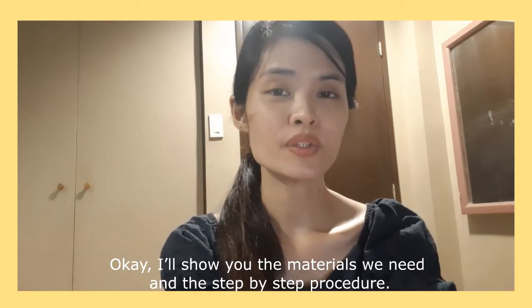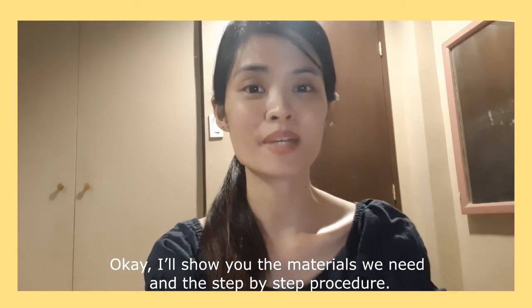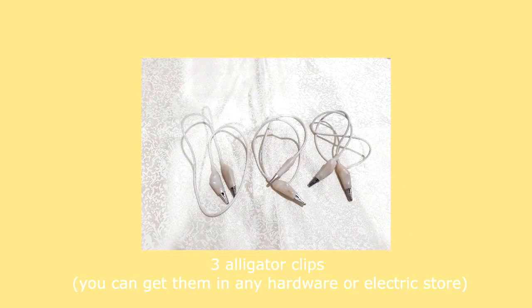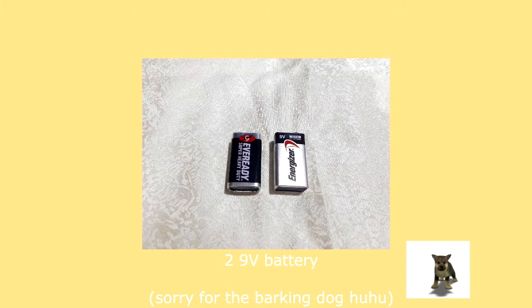I'll show you the materials and the step-by-step procedure. The materials we need are: 2 aluminum pans or stainless steel pans; 3 alligator clips — you can get them at any hardware or electrical store, and if they sell longer clips you may want to get them cut shorter; 2 nine-volt batteries; and 2 sponge cloths, which will be discussed in the next few minutes.